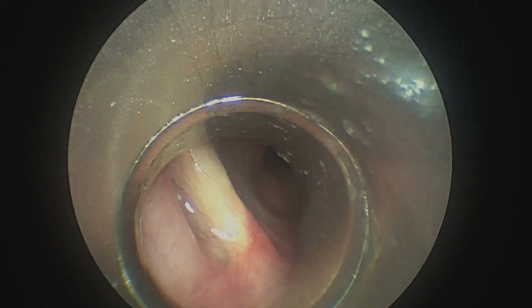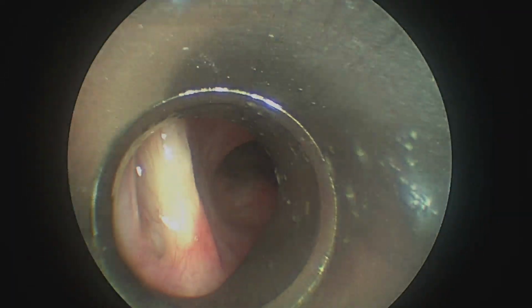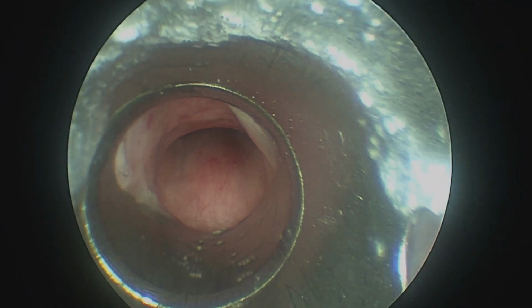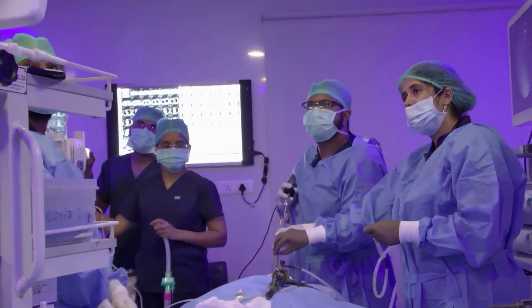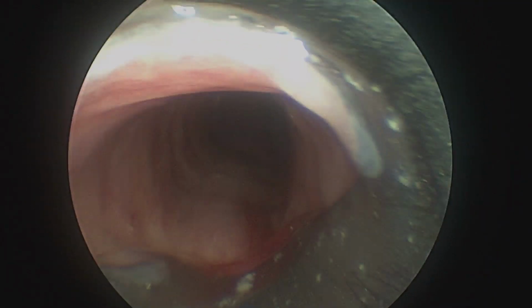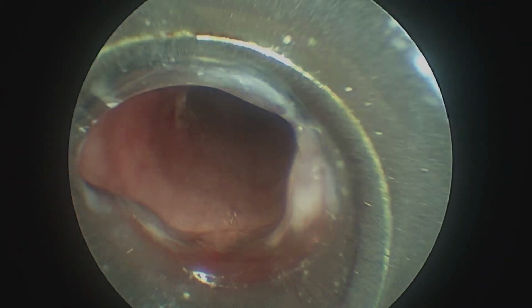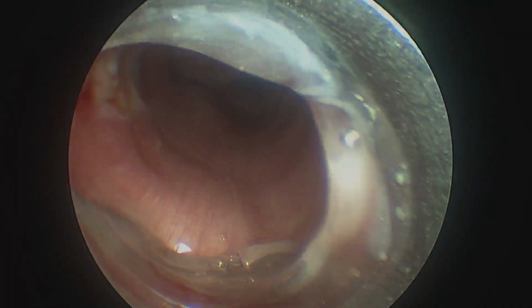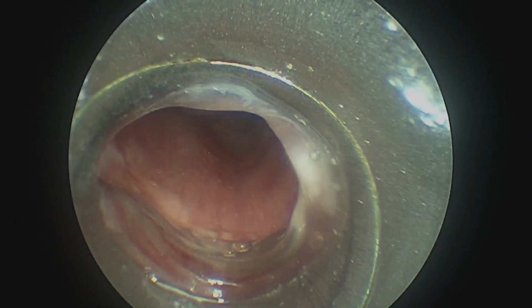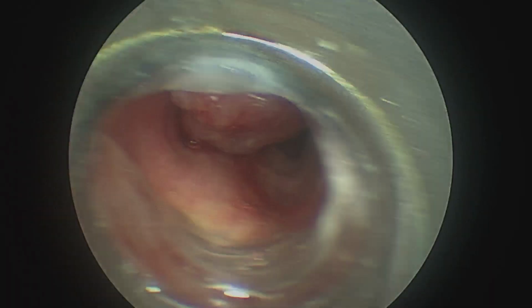Yes, ma'am. Advance the bronchoscope. You can change the hand to rotate the barrel and slowly advance. You have to maintain the axis always. Slowly rotate and advance the barrel. The rigid barrel should not touch the posterior wall. Advance the barrel little more. Okay, and we can now connect to the ventilator.